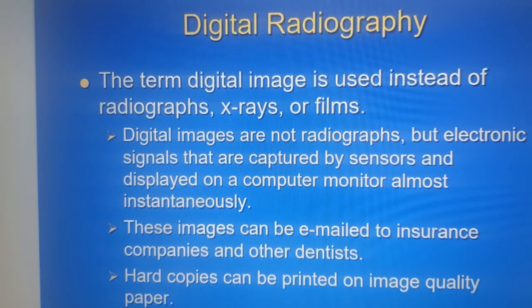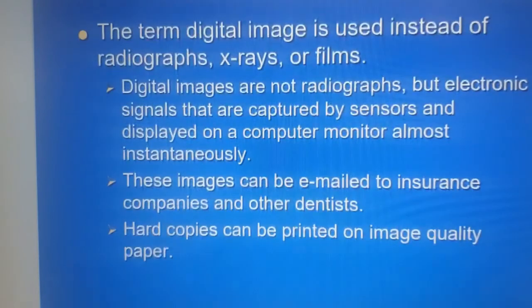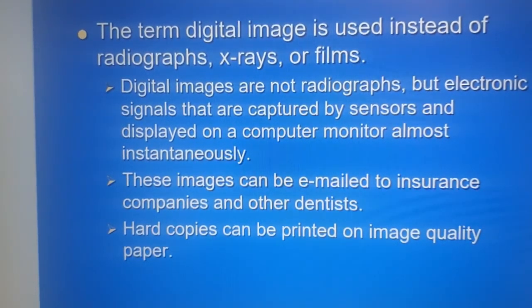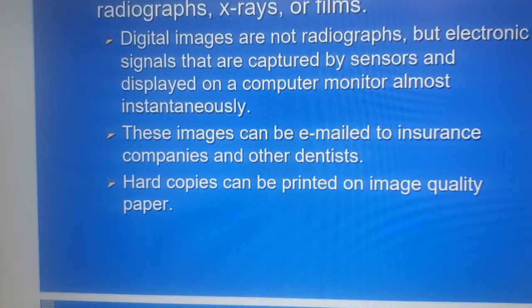Okay, so these images can be emailed to insurance companies or medical aids, in our instance in South Africa. But essentially, more importantly, they can also be digitized, enhanced, printed, stored, or even sent to other offices by email or even by post. But obviously in the age of technology, we'd then be using emails. Okay, if a patient requests hard copies, it's also easy for us to just print them by making use of the appropriate systems or software, so that the patient can actually get records wherever necessary.